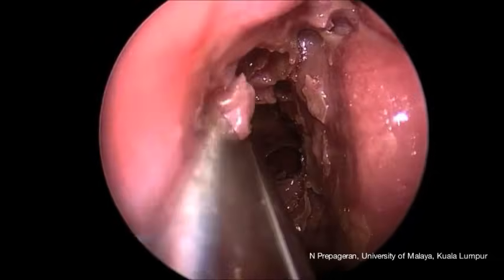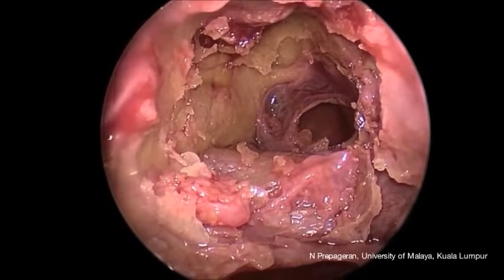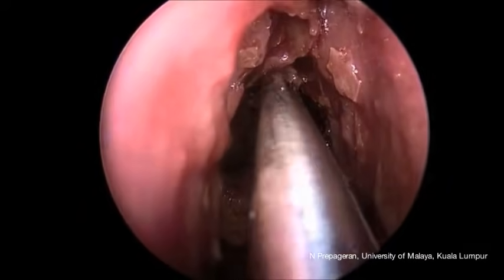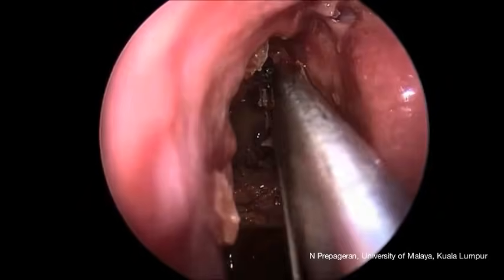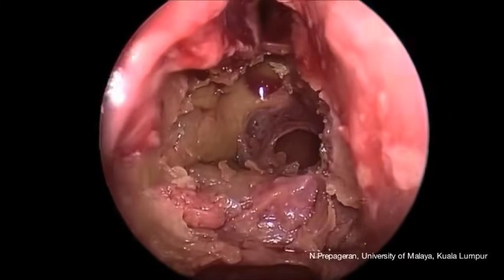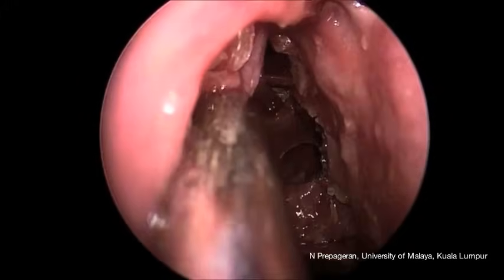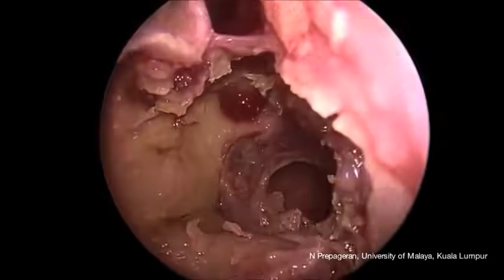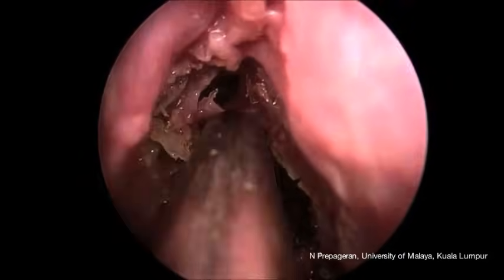Lateral to the ethmoids is the lamina papyracea. Using the Kerrison punch to remove the vertical bony ledges, there is a very nice view of the posterior ethmoid artery just anterior to the anterior wall of the sphenoid trans-ethmoidally — gate number four. Removing all ledges laterally gives a very nice view of the lamina papyracea, which forms the lateral border of the ethmoids. This is a total ethmoidectomy, which can be done very quickly in a matter of minutes with very few instruments, and the same speed can be achieved in real life once you are comfortable with the anatomy.